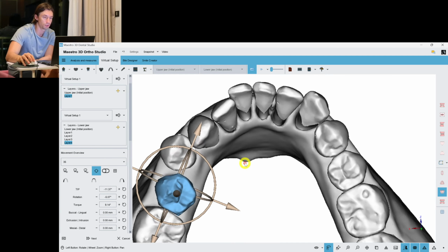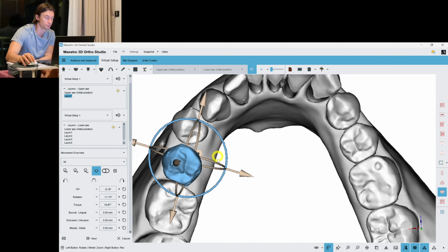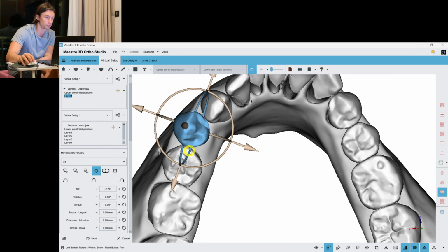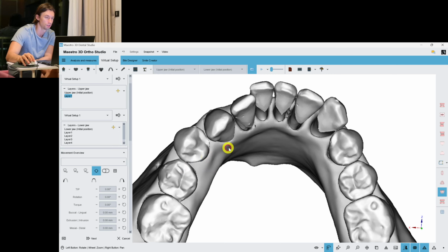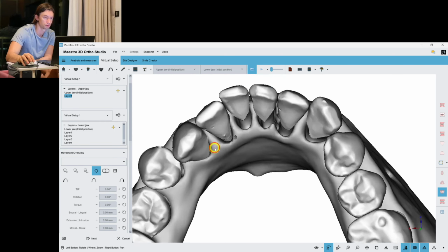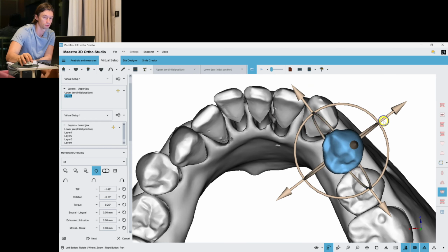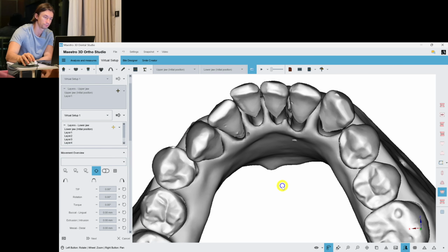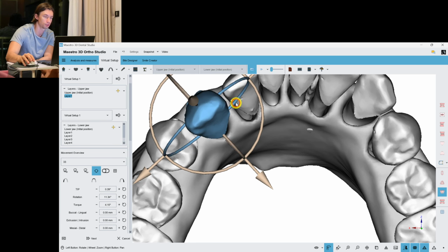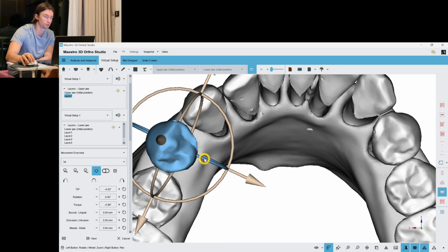It was layer 4, layer 5, some vestibular movement of the second premolar. Is there some bone? Yes, fortunately, yes. And we can make some distal tipping of the first premolar. Layer 6. We are moving the canine to the vestibular direction. And we can make some more IPR here.